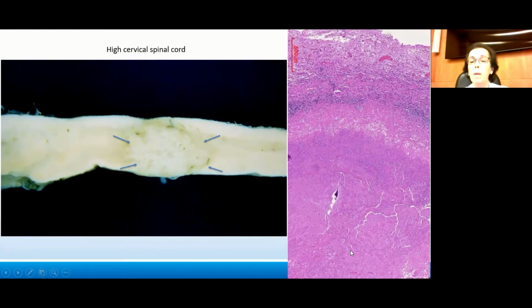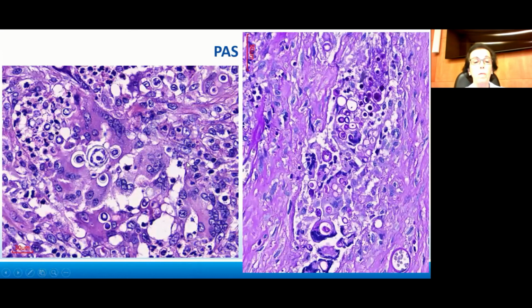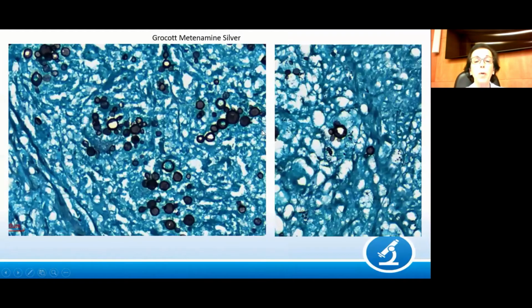this, again, a lesion that had extensive necrosis in the center, and then inflammation, and there are granulomas, which you can see here. Lots of giant cells. In this case, they contain the yeasts inside, here and here. They can also be free, seen towards the necrosis here. With the PAS, we can see them very easily. And with the silver impregnation, we can also see, and I used to take the opportunity to show that multiplication in this case is made by multiple buddings, as you see here, and as you see here, and also here.